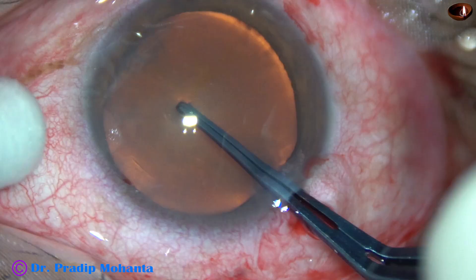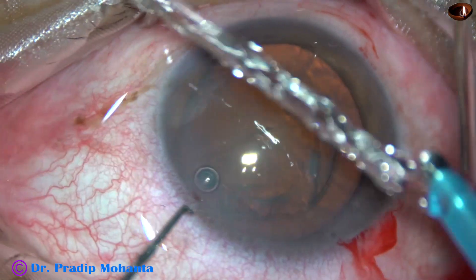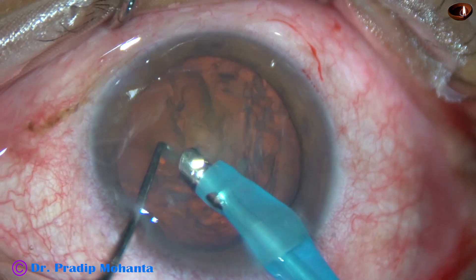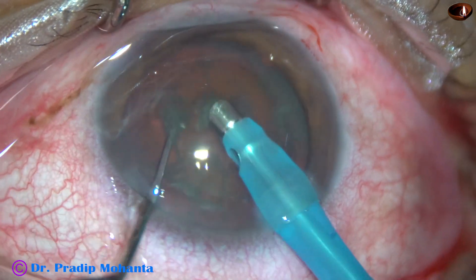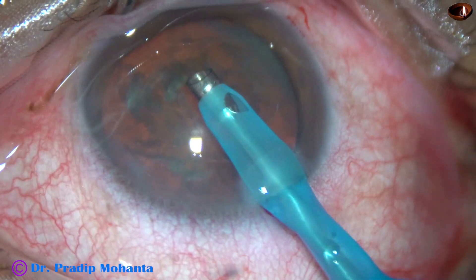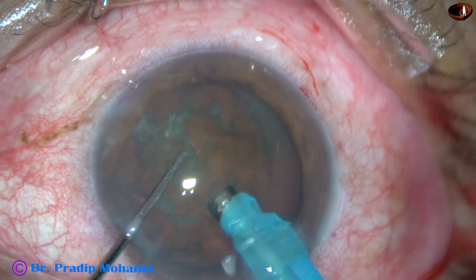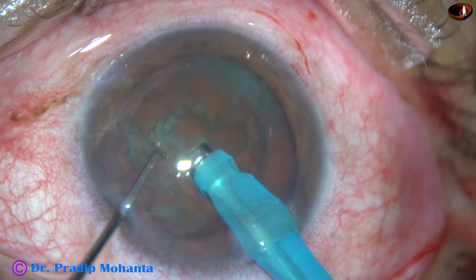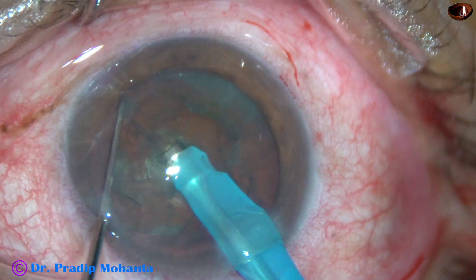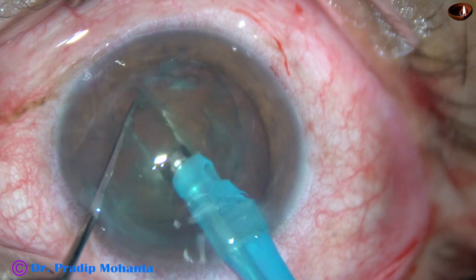This is a softer cataract. Let us observe this case. After capsulorexis and hydro-dissection, the tip of the phaco needle is introduced. Some superficial lens matter is aspirated. The handpiece is turned and the bevel is made up. Now I try to bury the teeth and hold it, but I could not hold it. So I go a little forward and I could not make a nice crack.